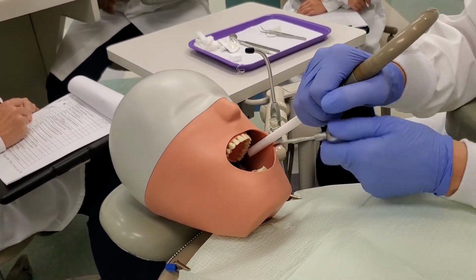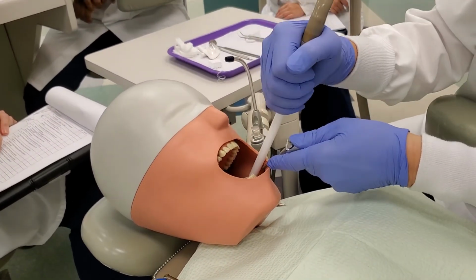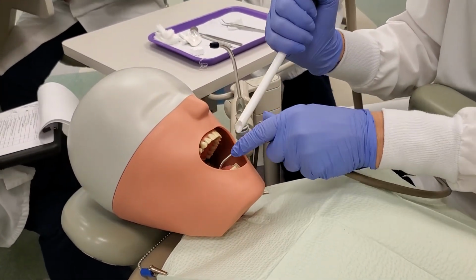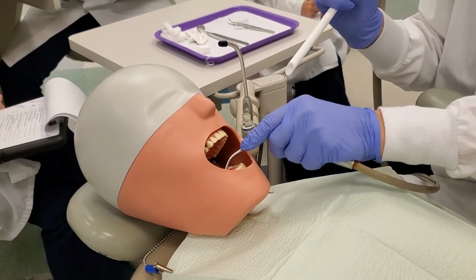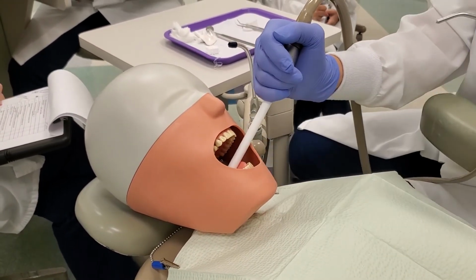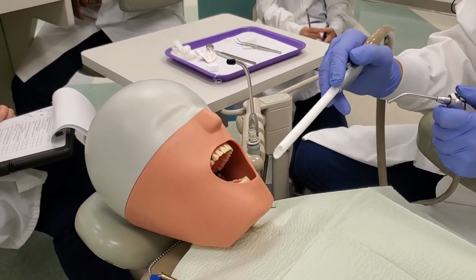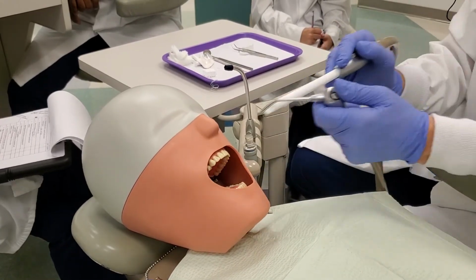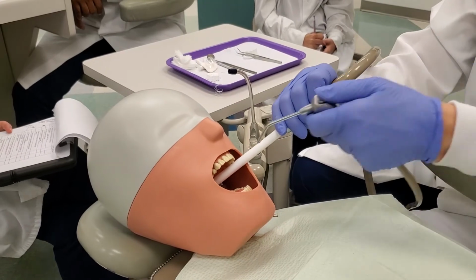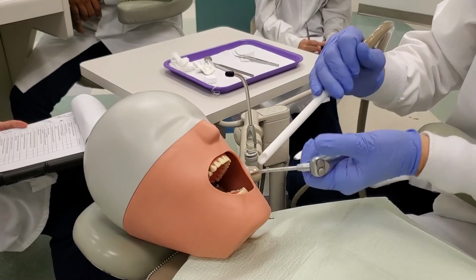Retract, place it in the back. Same thing you just did. Back, midline, back. Retract, place this, back, midline, back. Now you're doing that lower right. Retract the tongue with your air water syringe. Place this where it needs to be. Rinse, boom, boom. Okay? You are not moving this, except to go from quadrant to quadrant. You're not going to be following this guy because that's where you're going to be sucking tissue. Just keep him in the back of the throat because that's where the water is going. Okay? This guy's the one you're going to run.